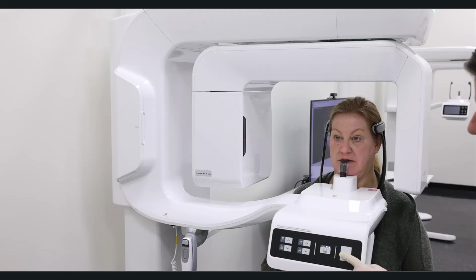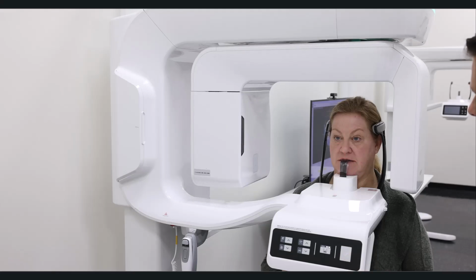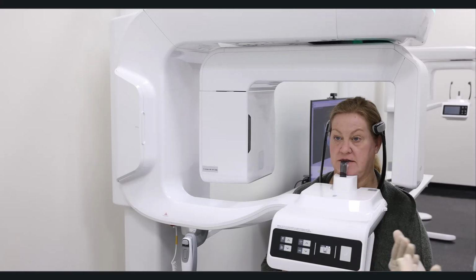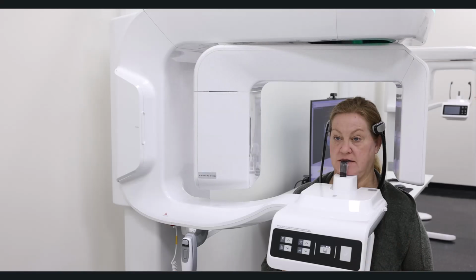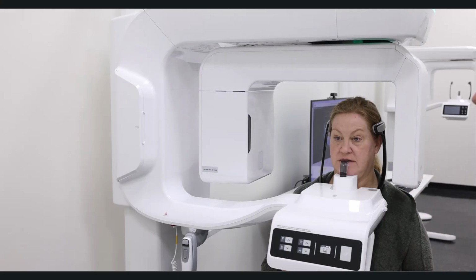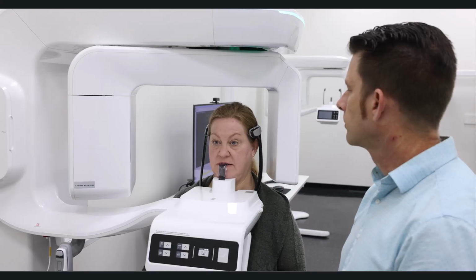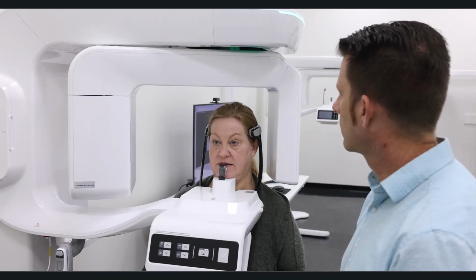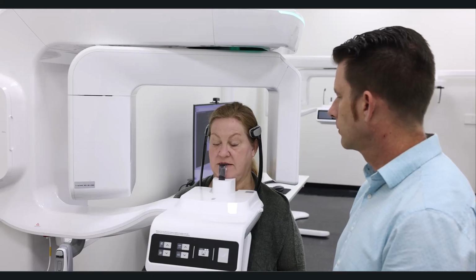I'm going to go ahead and click on the check mark or the ready button here. The system is moving into image capturing position. Please wait. The device does provide instructions again to have the patient close their eyes. In this case with the pan, I'm going to wait until it tells the patient to close their eyes, then I'm going to go capture the image. All right. The system is ready to capture an image. Please close your eyes until image capturing is complete.